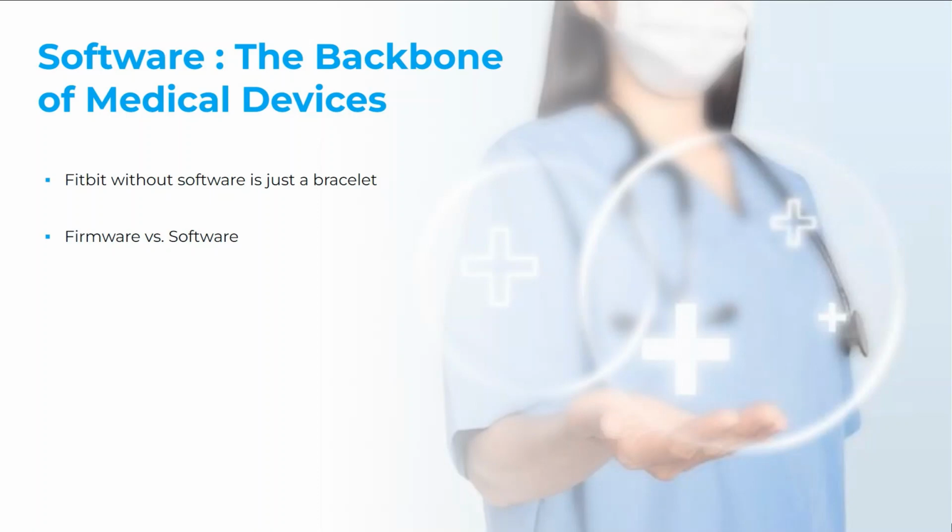So I'm just going to go into a little bit more of what is and isn't software as a medical device. So it's really going to be if there's, like, an EHR. We did electronic health records in an earlier webinar. That is not software as a medical device. But if there's a piece of the EHR, for example, some software that's tracking the size of moles within your EHR.